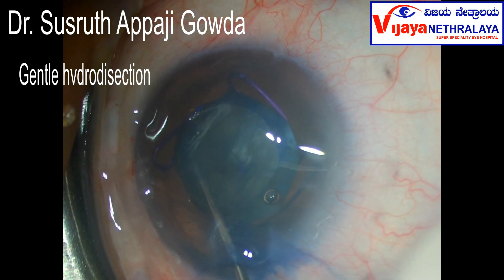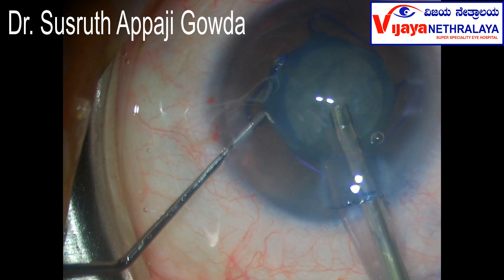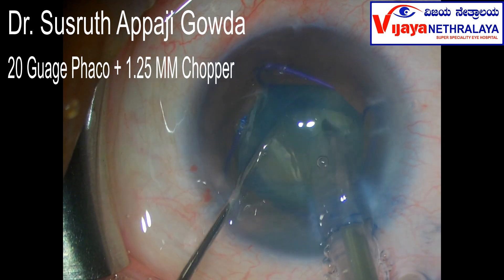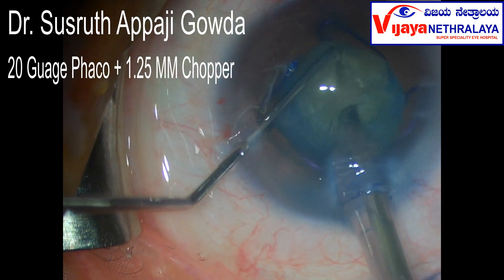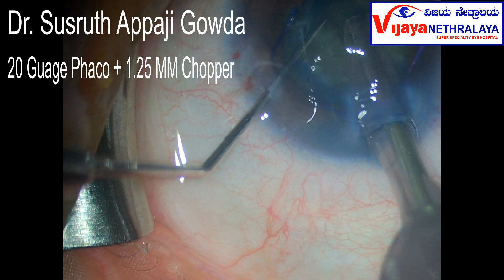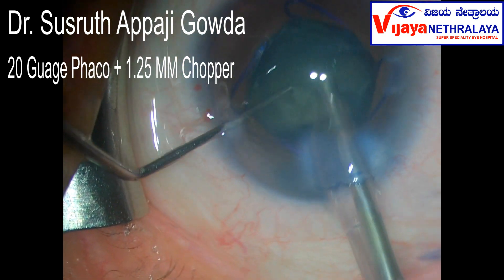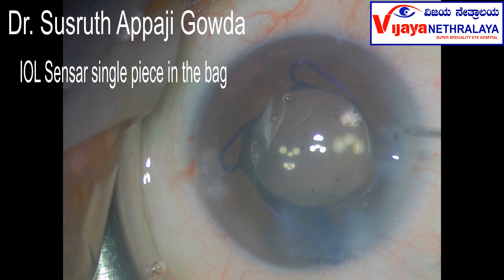I'm doing very gentle hydrodissection here, injecting small quantities and decompressing repeatedly. It's a very shallow anterior chamber. Phacoemulsification was introduced — it's a lengthy surgery and I'll only show bits and pieces. I went very slow and conquered the surgery bit by bit; it went on for more than 40 minutes. The machine I'm using is Signature Pro; bottle height was around 60 cm, flow rate was around 50, vacuum was around 550, and I was using occlusion sensing technology. Without occlusion I was using long pulse, and with occlusion the machine goes into continuous mode. It's a beautiful machine and I'll not trade it for any machine currently.